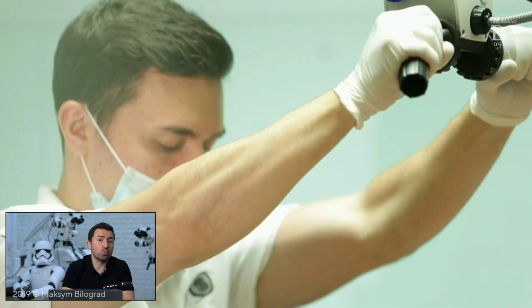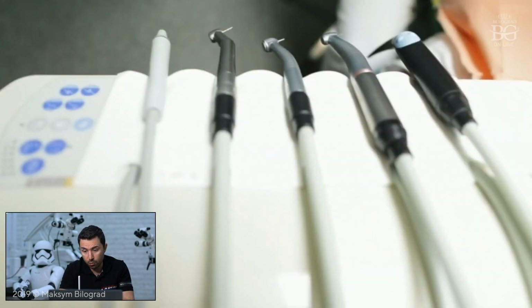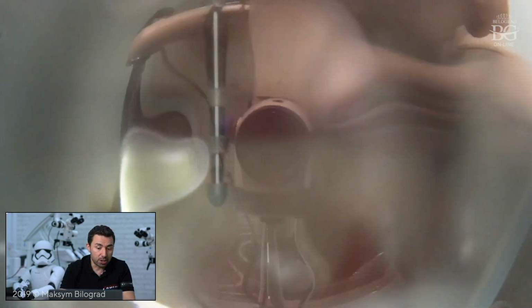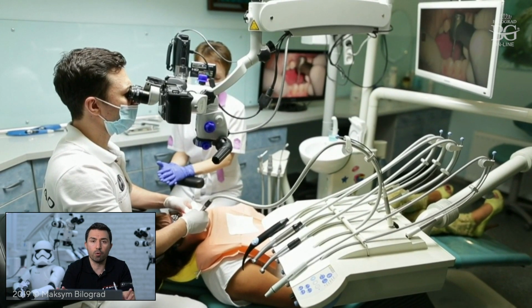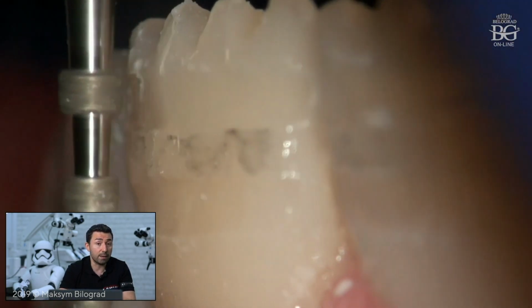Our preparations were guided through the mock-up. We discussed color with the dental technician. We discussed the space that he has to have. In other words, we discussed how thick veneers should be in order to change color from A3.5 into BL shade. And he gave me a number, let's say 0.5 or 0.7. Then I took my depth cutter and started to prep teeth through the mock-up with that depth.